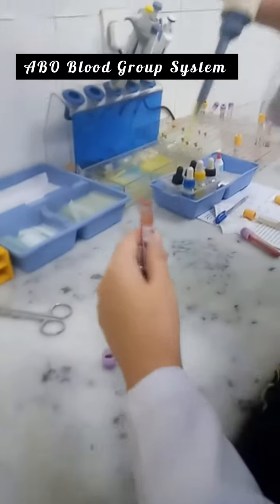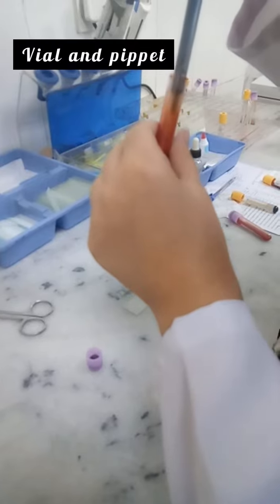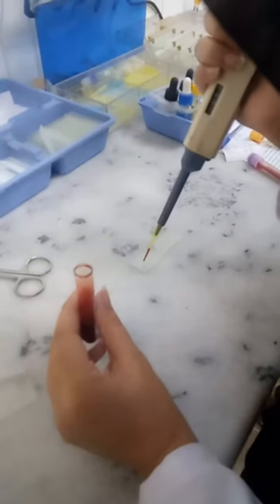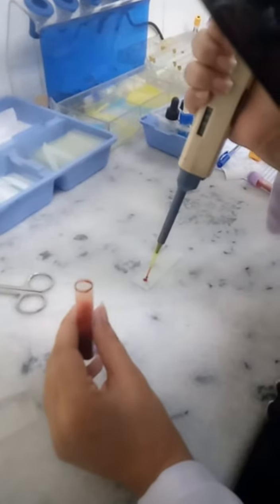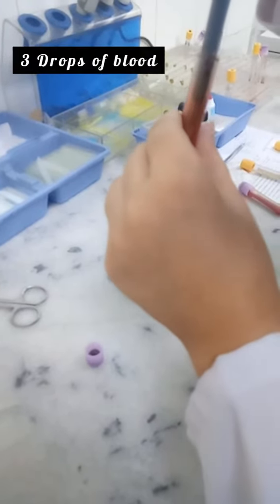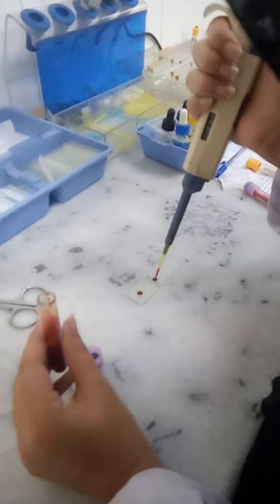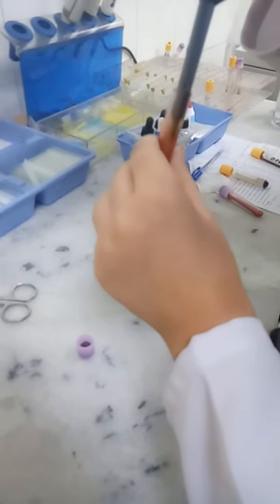Hi guys, today we are going to do blood grouping. As you can see, I have a vial and a pipette. I am taking out a drop of blood and placing it on the slide. We need three drops of blood and we will do it one by one. This is the second drop of blood, and finally the third drop of blood.